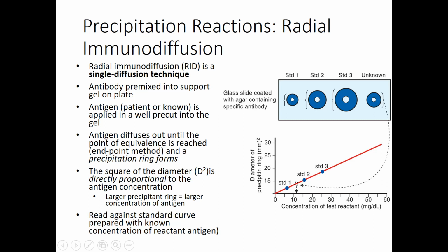It's a standard curve. Again, I'm going to send you the link, and I'll make sure it's uploaded on the PowerPoint that gets uploaded for this, with the correct link. I apologize. And you can see the formation of precipitation within a gel.